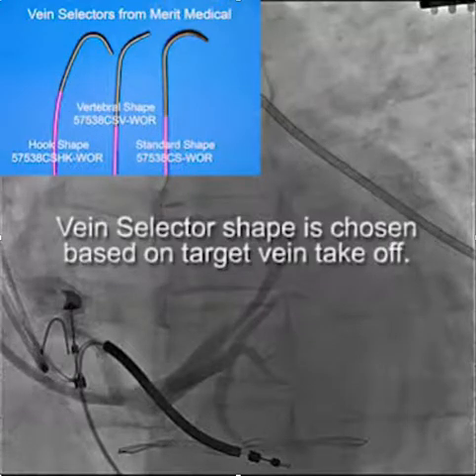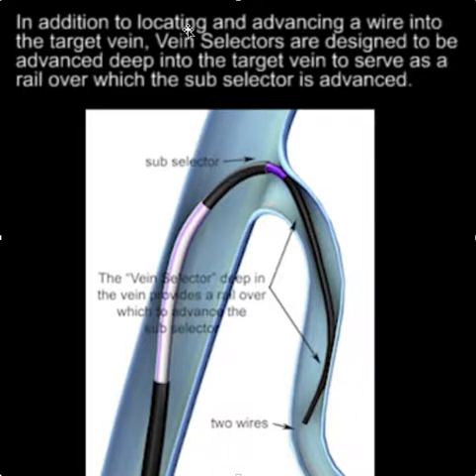And in addition to locating and advancing a wire into the target vein, remember that vein selectors are designed to be advanced deep into the target vein to serve as a rail over which the subselector is advanced. So here you can see we have our vein selector deep in the branch over two wires, and that allows us to rail the subselector over the vein selector into the branch.